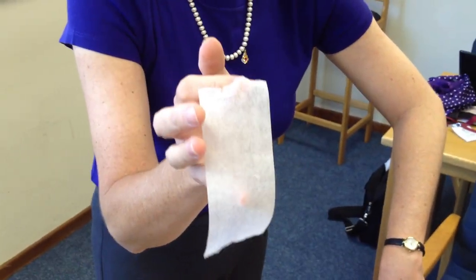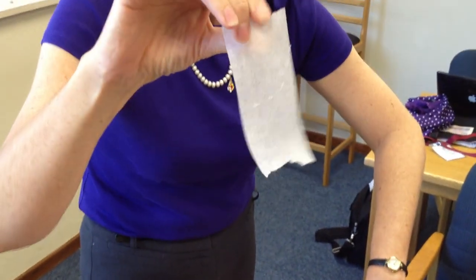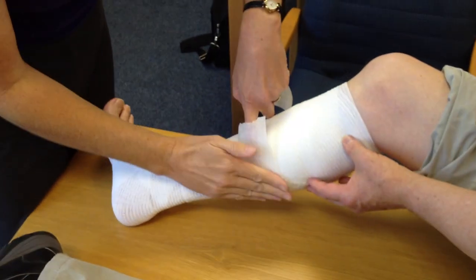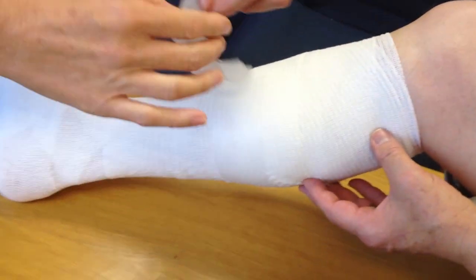Tape it down. This is an ordinary retention tape — a paper-based tape. Use a broader tape rather than fine strips, because fine strips on their own can add extra pressure. The purpose of this is just to secure the bandage, not to add extra pressure.